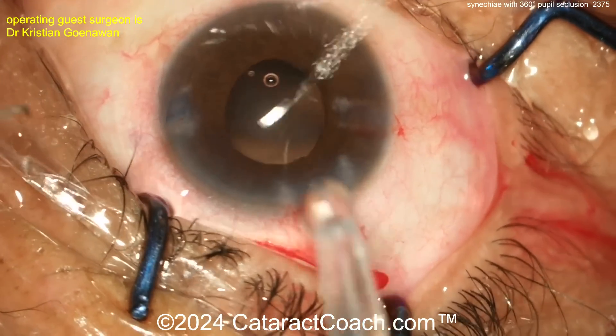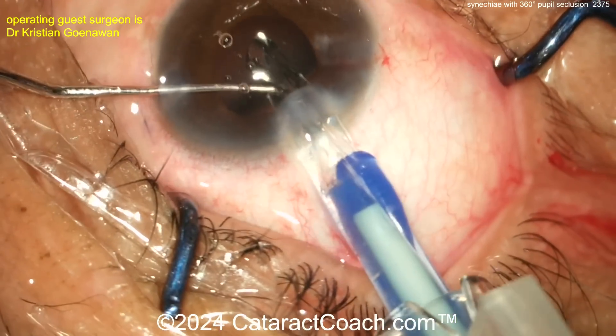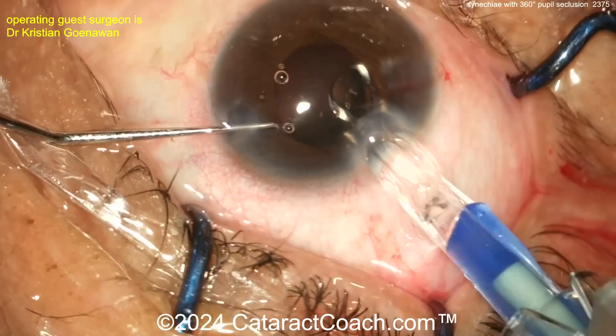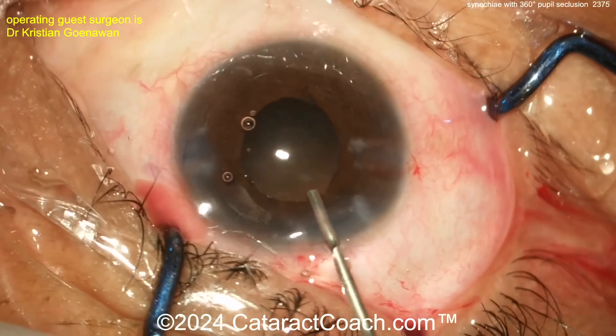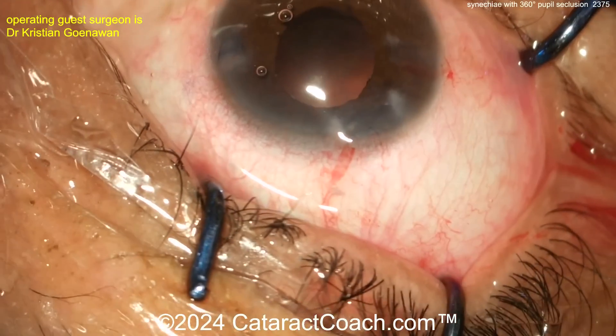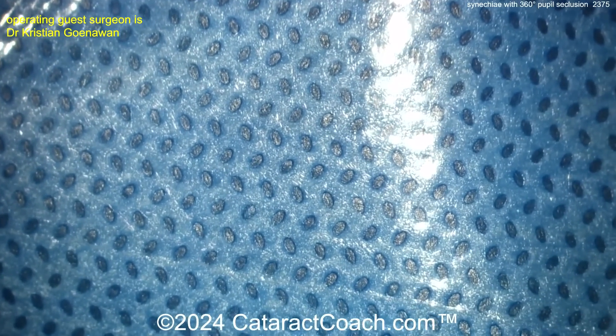This case will likely have more inflammation in the post-op period, so be prepared for that and consider more steroid treatment. Now look at the injector — it's poking through the wall of the cartridge. Injecting the lens and — this is the surprise complication — the lens is getting stuck. Possibly a misload on that lens. The better option here is to reload it, or if the lens is damaged, get another one. Sometimes your technician needs your help loading the lens; in fairness, they don't have a high-power microscope, so it's much harder for them to see.